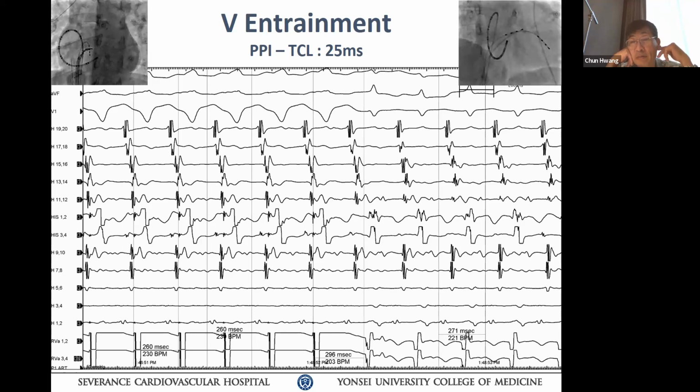그래서 내가 summarize 하면은 첫 번째 캐터스 CS 캐터를 좀 더 tight close spacing 하는 캐터로 바꿨을 거고, 두 번째는 LB pacing 해서 differential 했을 거고, RB, LB. 그 다음에 이제 다른 거 할 수 있는 거는 you can do the left side annular pacing as well to look at the pre-excitation index this patient. That would give you some idea, rough region to ablate.